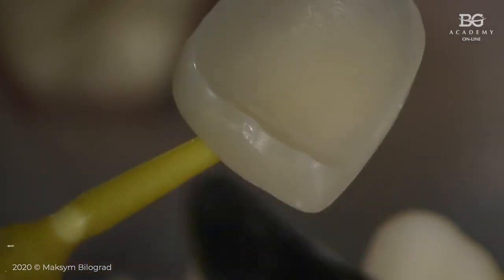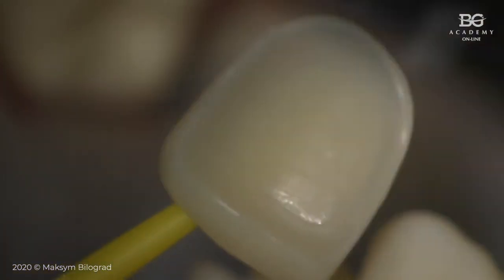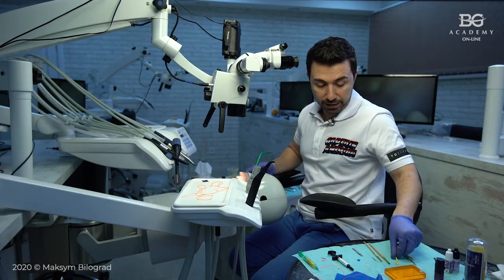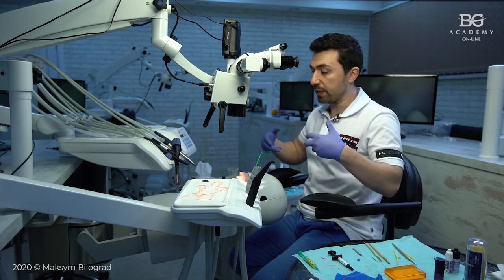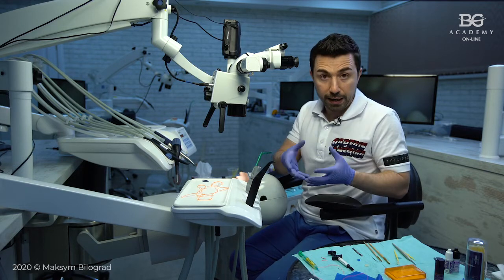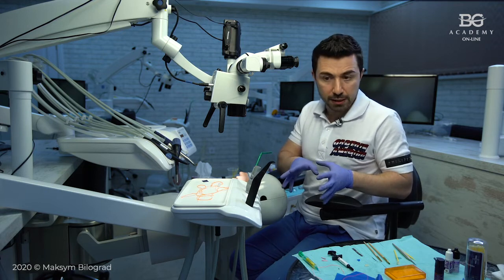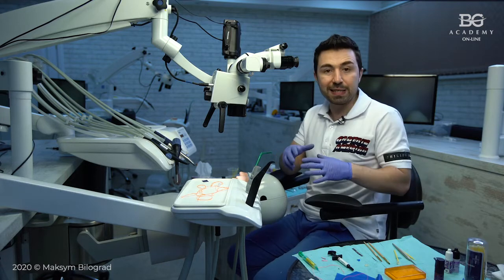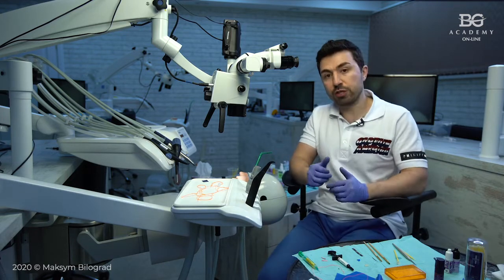This is an important thing. Once you etch your ceramics with hydrofluoric acid, or your dental technician does, or your assistant, doesn't matter, once it's etched, the surface of the ceramic becomes very sensitive and reactive. It's hydrophilic, and everything that comes to the surface will contaminate it. And these pores that were created by etching will be contaminated with any contaminants. So you have to provide silanization immediately after you etch the ceramic system.